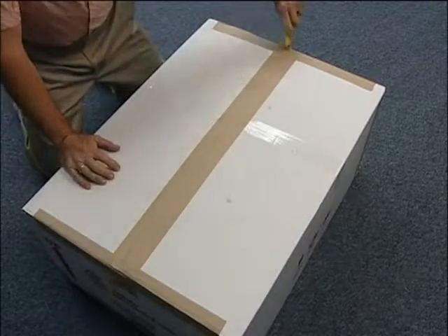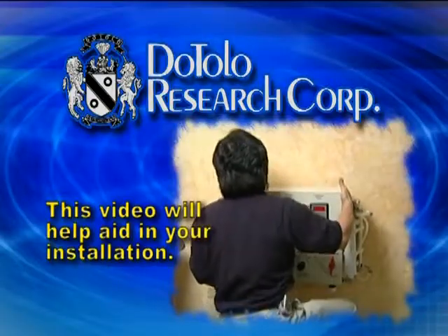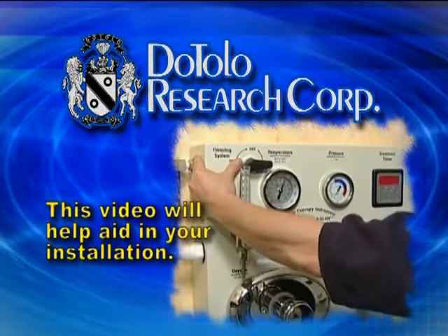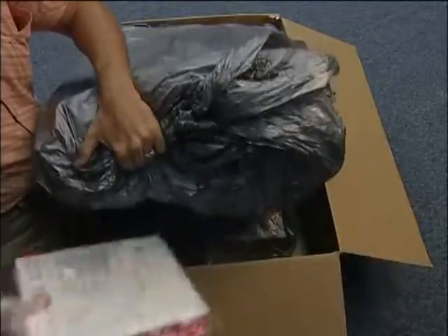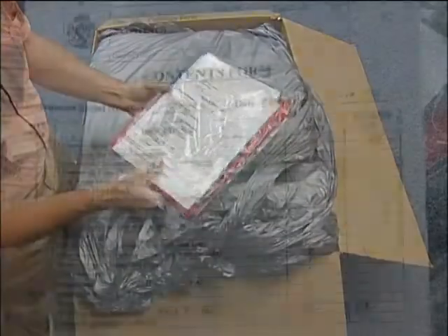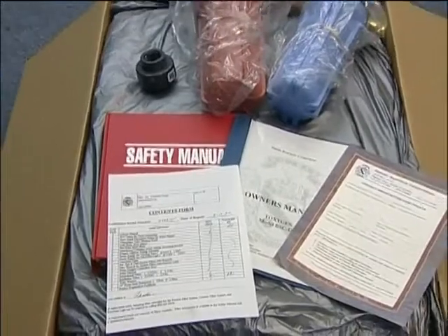Thank you for your purchase of the Dottolo Toxygen Colon Hydrotherapy instrument. This video was produced to aid you in the installation of your Dottolo Toxygen Colon Hydrotherapy instrument. Please locate the contents sheet in the shipment and inspect the contents, making sure that all of your items are included.